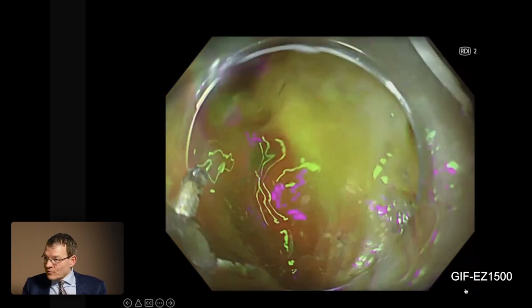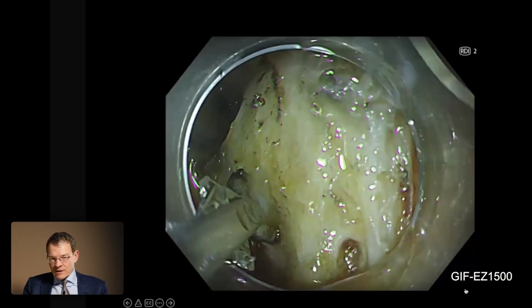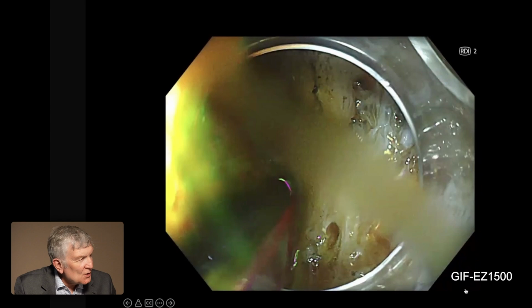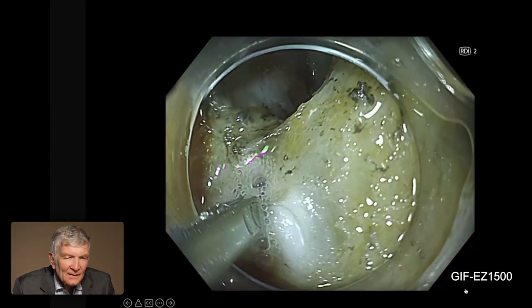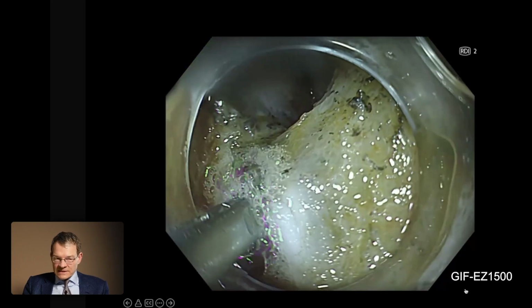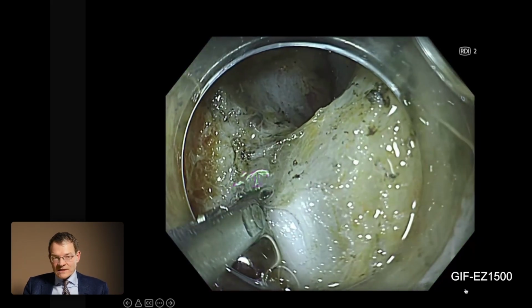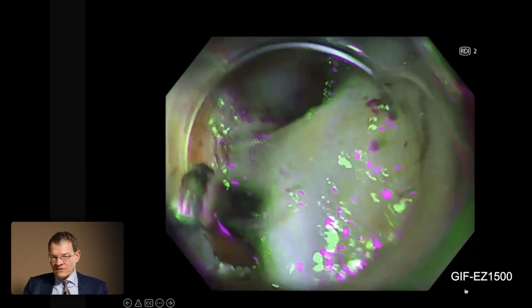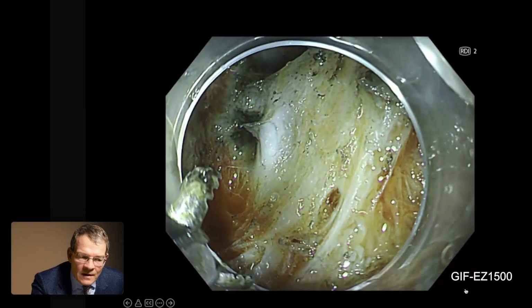Cap is also very important, and here we are now coagulating the vessel. Yeah, so the nurse is going for the forceps, or what, you could compress the basis with a cap. Exactly, then, yes. So this is a nice example. That was a relatively more heavy bleeding during the ESD, but in this situation we saved time and we could better visualize the source of the bleeding.